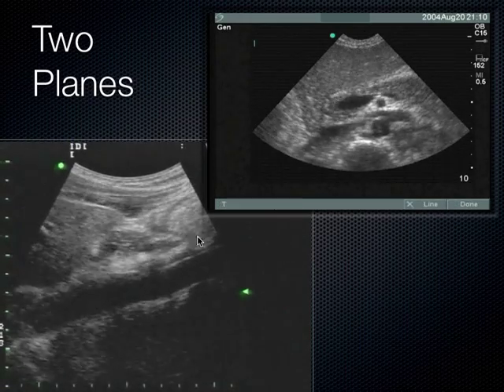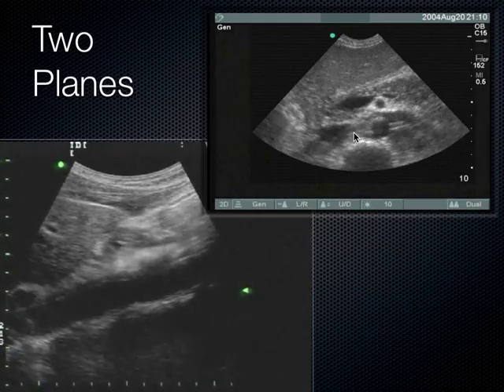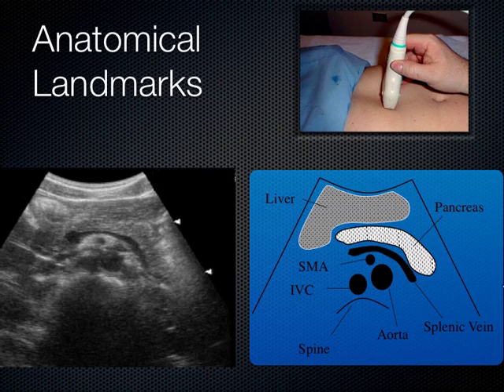We'll look at the aorta like we do most things in two different planes. On the left you see the sagittal plane, and over here we see the transverse plane. I usually start with the transverse plane. I aim the indicator to the patient's right, and then I push down really hard, but with gentle, continuous pressure, until I can see the spine shadow.